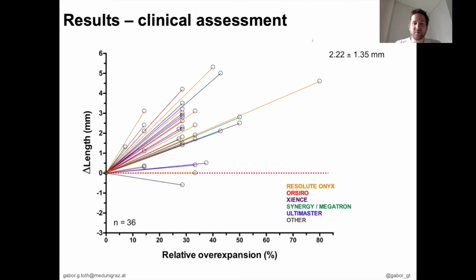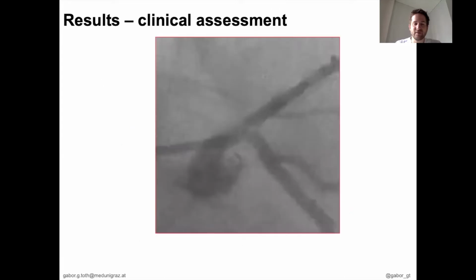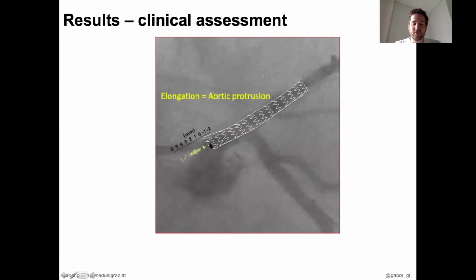How we can interpret it in a clinical perspective? So let's put these findings and try to interpret it within this one single distal left main bifurcation case, where when the stent is placed and has to be corrected proximally with proximal optimization, if the stent is placed nicely to the ostium, then by proximal optimization, we might end with such a proximal aortic protrusion demonstrated by the yellow lines coming from the data from our cohort. And it's easy to realize that such protrusion might have relevant clinical and procedural consequences.